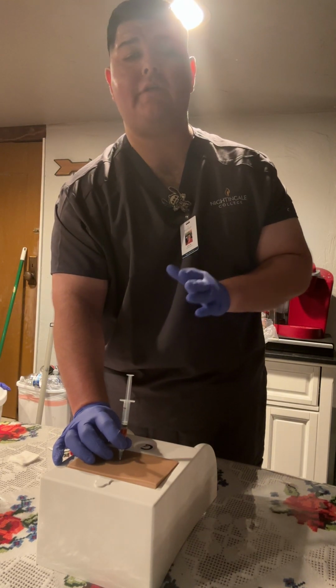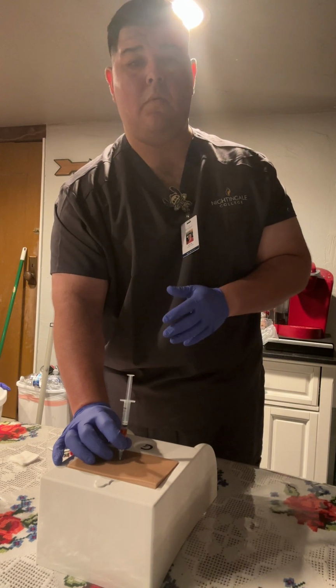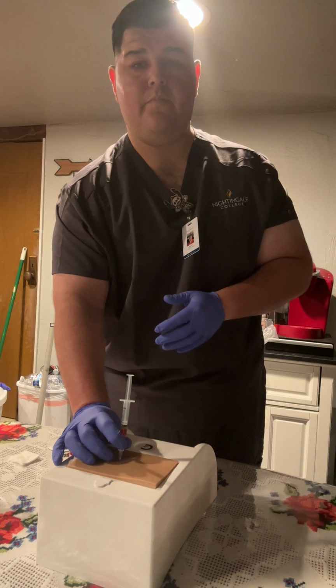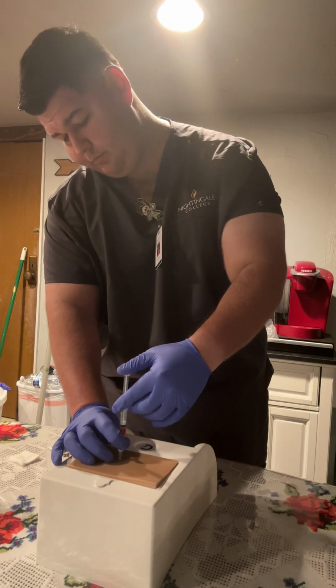I want to inject 10 seconds per milliliter while still holding pressure with the ulnar side of the hand. So here we go.